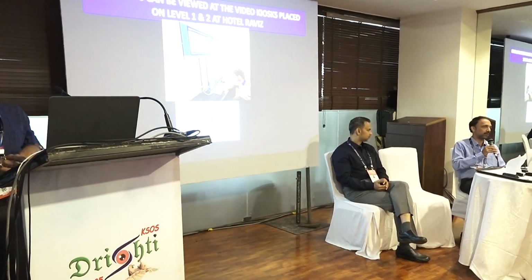Thank you, sir. So how difficult is it to get a wide field OCTA in a busy OPD? I mean, do you just click and the whole wide field comes? Because with the montage, it's extremely difficult.